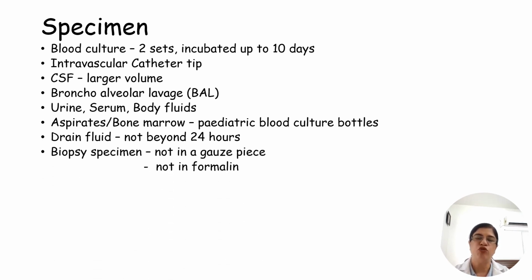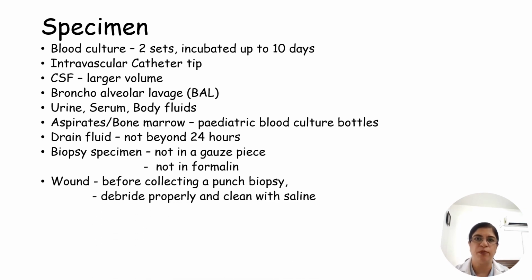Biopsy specimen should not be collected in a gauze piece if it is being sent for fungal diagnosis, and never in formalin. Wound swab should not be used, and a punch biopsy is ideal. And before collecting the punch biopsy, the wound should be debrided properly and cleaned with sterile saline. Swabs are not preferred other than oral and vaginal.